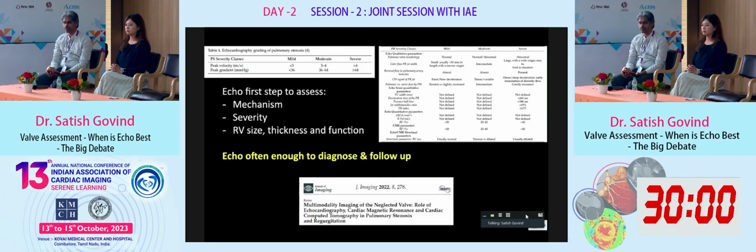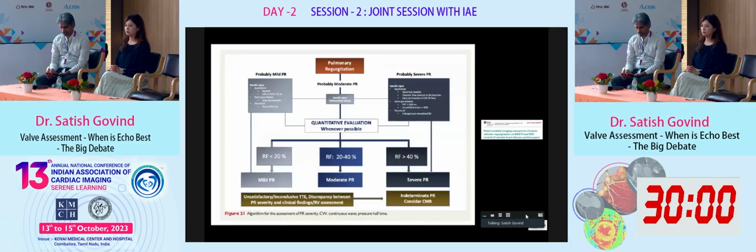And then as far as echo is concerned in terms of stenosis, it is fairly simple here. You have very limited parameters, but PR is something which is a little bit of a gray area. There are many areas where echo still doesn't have answers in terms of validation of mild and moderate. So that's a problem. But in a broad sense, most of the time echo is able to provide answers and is enough to diagnose and follow up. But when it comes to complex lesions or transcatheter interventions, then we may have to look beyond echo.